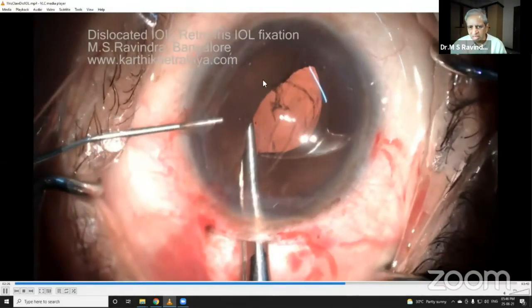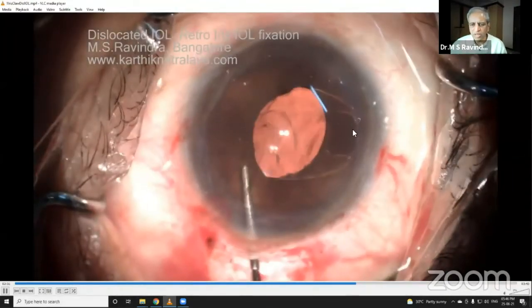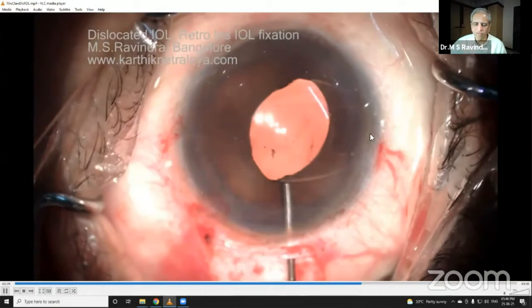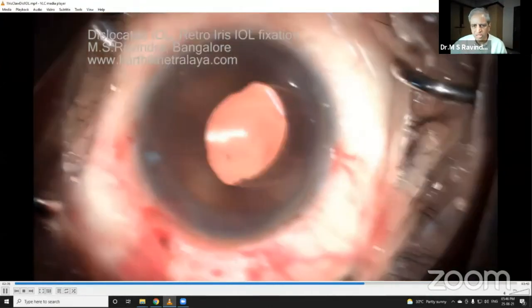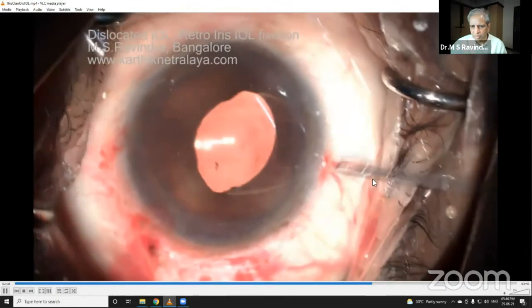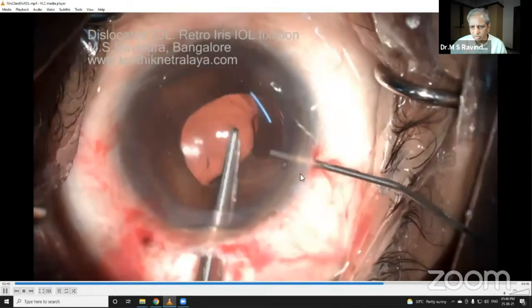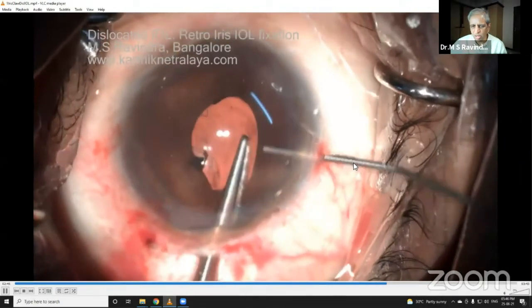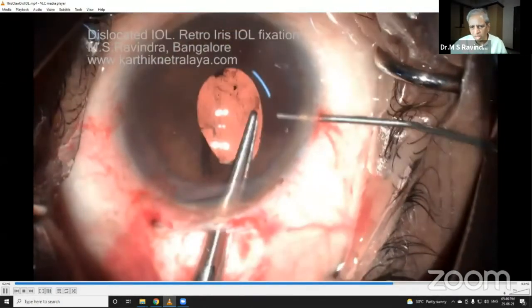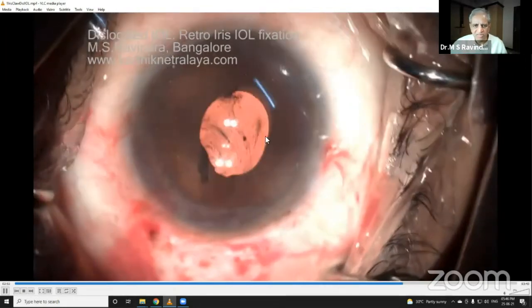Then lift the haptic — now you can see it beautifully got enclosed. This is a very quick, very easy technique. You're sure that you've fixed the iris into the enclave. I'm ready to enclave, and using a shorter cannula so it doesn't touch the lid — and that's done. The anterior capsular surface is intact.